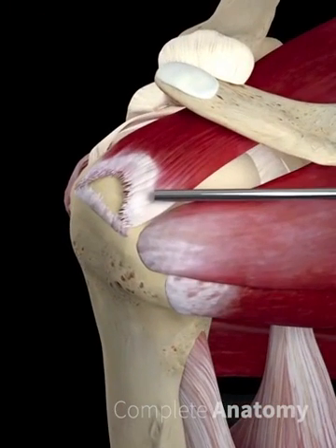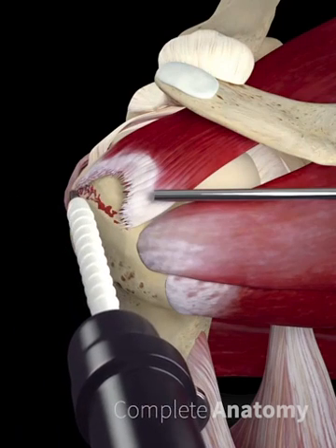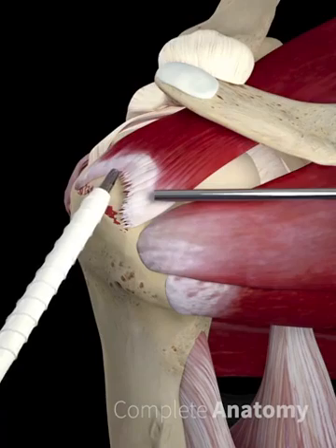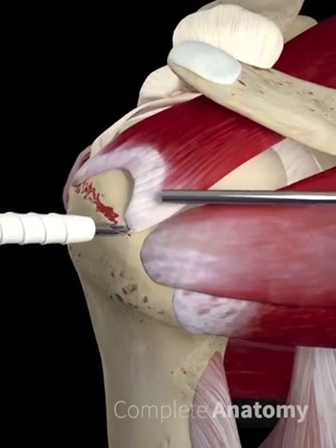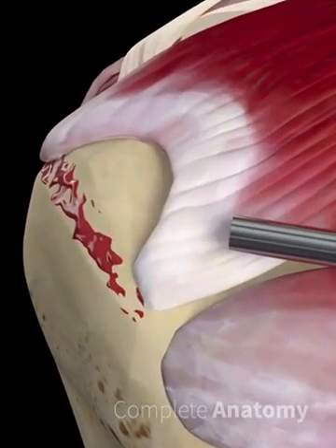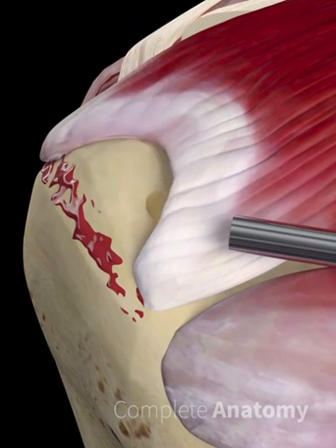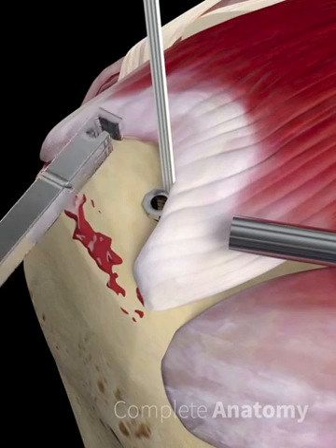The damaged tissue surrounding the tear is removed and frayed edges are trimmed and cleared. Holes are drilled and suture anchors are embedded in the bone at the natural attachment site of the tendon.